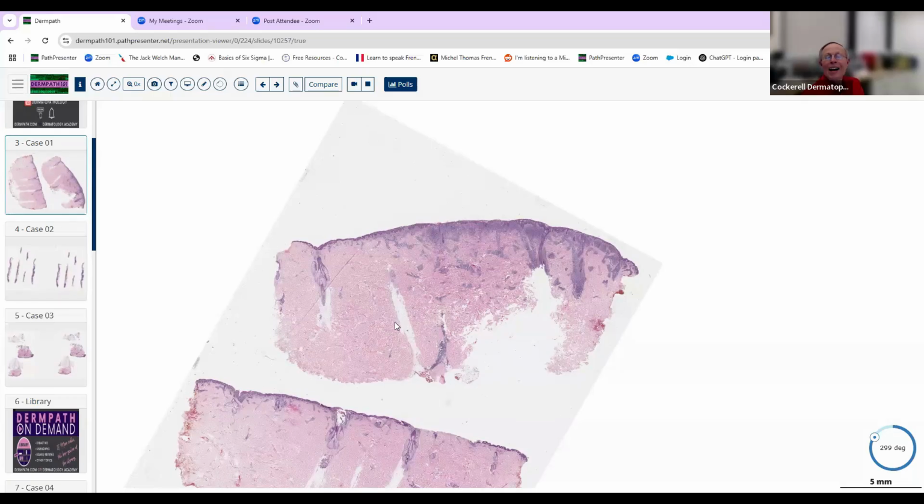If you just start putting things down and then you start trying to see what's given in the choices, you're going to sometimes be frustrated and start panicking, and then you're not going to be calm. And unfortunately, that's how you end up making mistakes. So we always start off the same way. What kind of biopsy are we looking at?